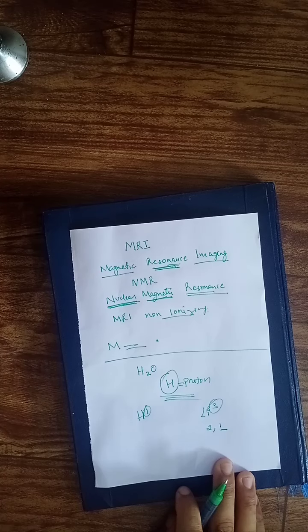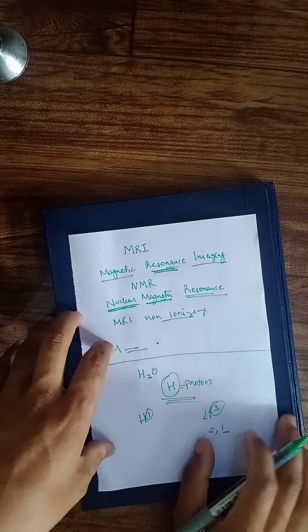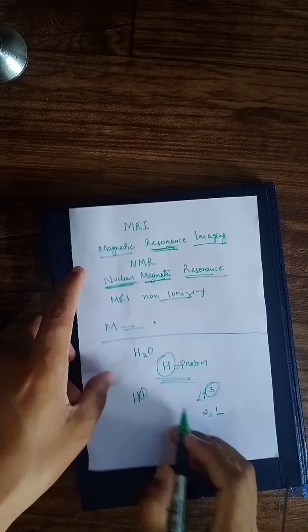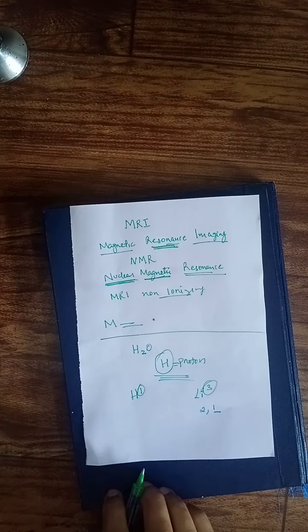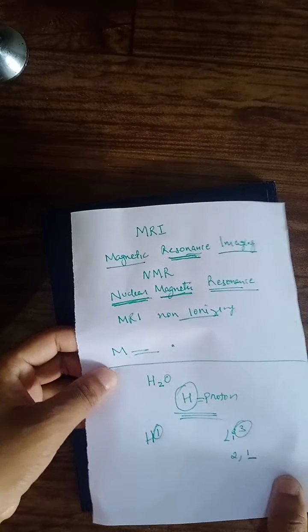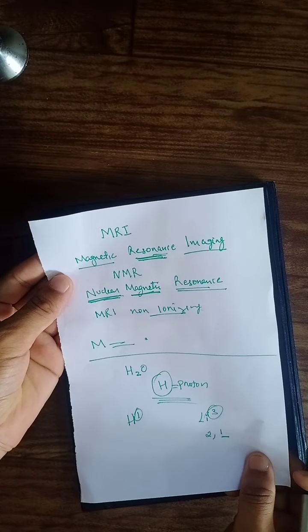The inner structure needs to be visualized. That's why we are using MRI, right? So this is the reason why hydrogen, which is highly present inside our body, matters. Now we will be discussing further, highlighting all these protons, which are very important. So I hope this much is clear.